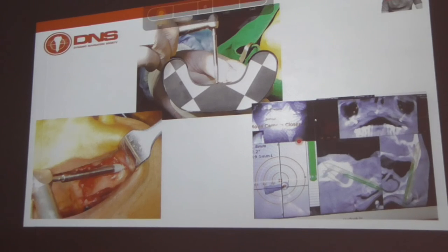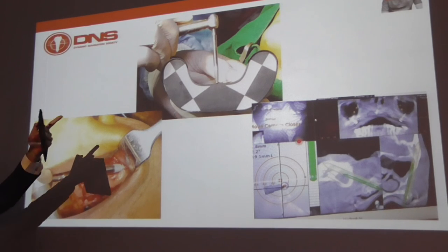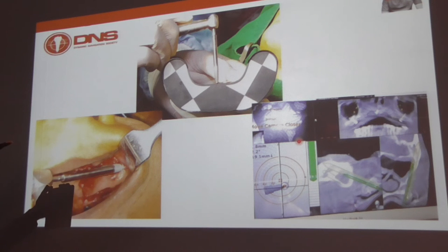Then I also calibrate my zygoma and place the zygoma under navigation. One reason is, if I am doing a flapless zygoma, I drill it once, but I can't find the point when I try to place the zygoma. If I don't have navigation, I'm searching for my point inside the sinus. So with this, it becomes pretty much easy.